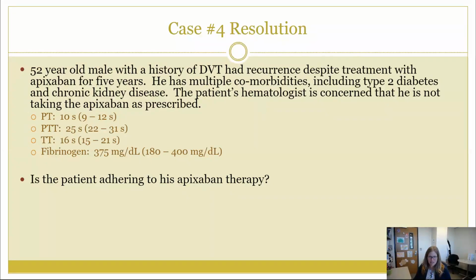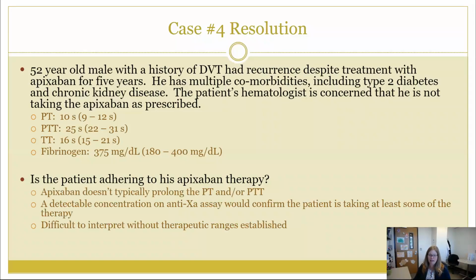The other case was a patient who had multiple thromboses despite being on apixaban for 5 years, and the providers worried that the patient might not be taking their medication. So is the patient adhering to his apixaban therapy? Again, the PT and the PTT are typically not prolonged by apixaban, so the fact that these are normal does not necessarily mean that the patient is not taking his apixaban.